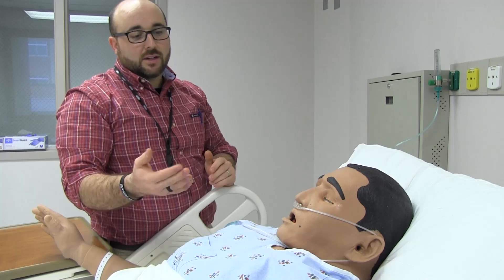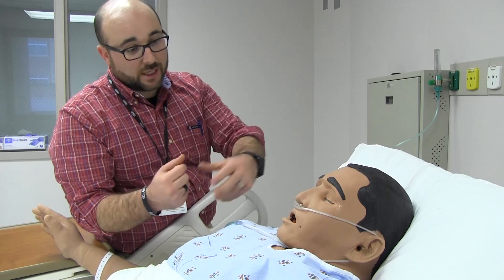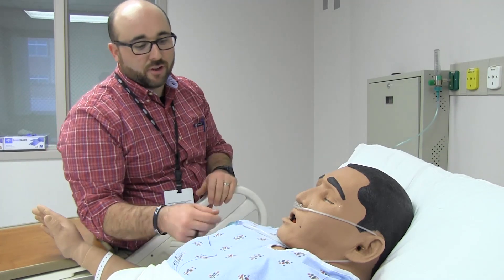This is how nasal cannula works. It goes back into the nasal cavity and acts almost like a reservoir, so when they take their breath in, they'll pull that fraction-inspired oxygen down to their lungs. Then they exhale, and take the next breath in.